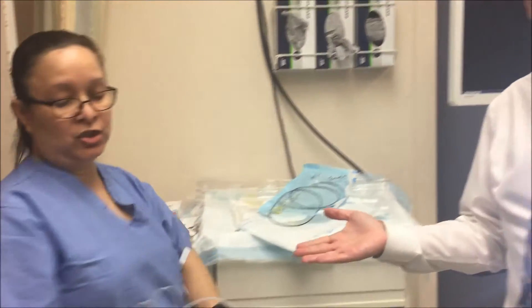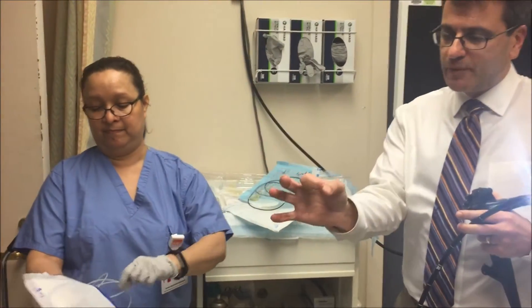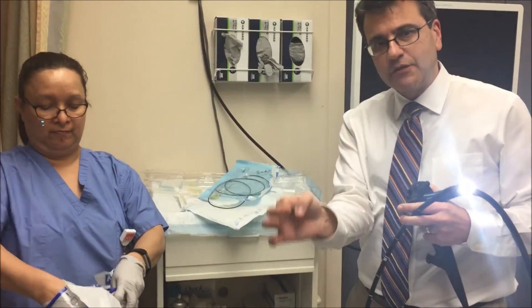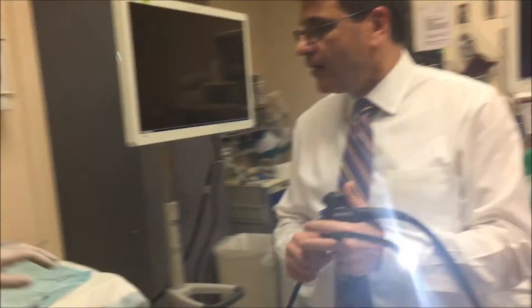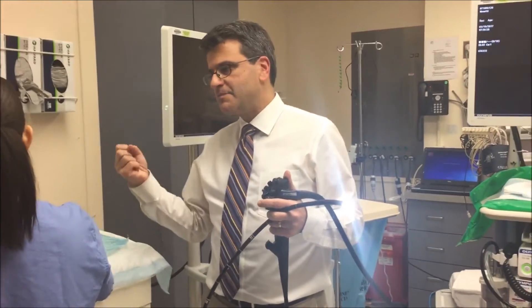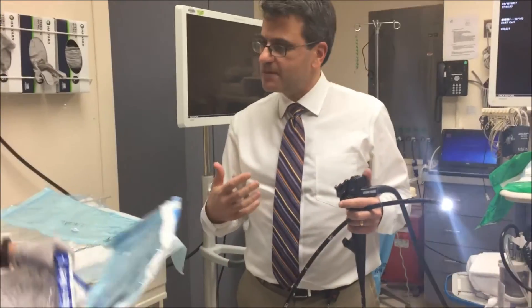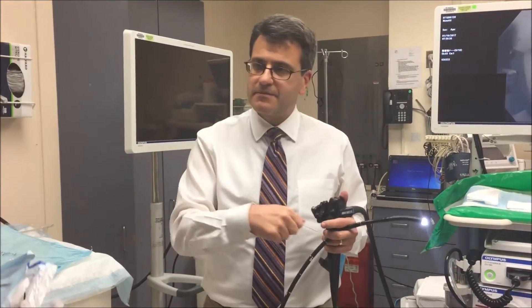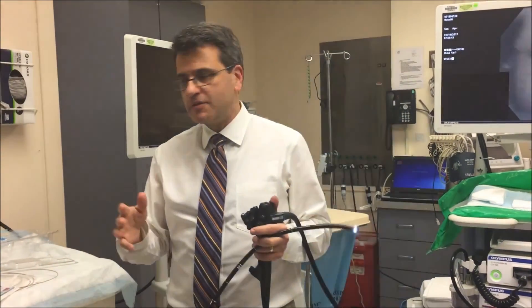A snare looks just like the basket — it's just the same but without the little basket net. It'll put a loop around whatever you're grabbing, you close it on it and the loop just grabs it, then you just take it out. So that pretty much summarizes taking out foreign bodies — we've got grabbers, snares, baskets, and the overtube. Sometimes it's painstaking and you've got to go multiple times and whittle away at it until it comes out, but it's easy once you have the overtube in.